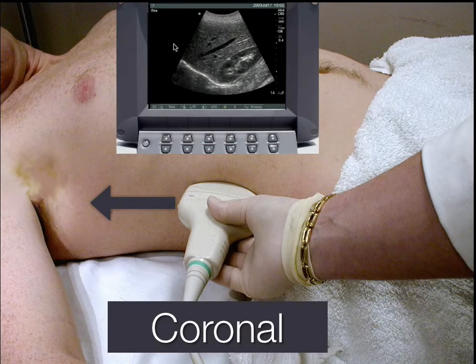This is still towards the patient's head. This is still towards the patient's feet, just like a sagittal plane, but because we're coming from the side of the body, skin line is now laterally, and this is medially going in here. Okay, this is towards the spine, if you will.